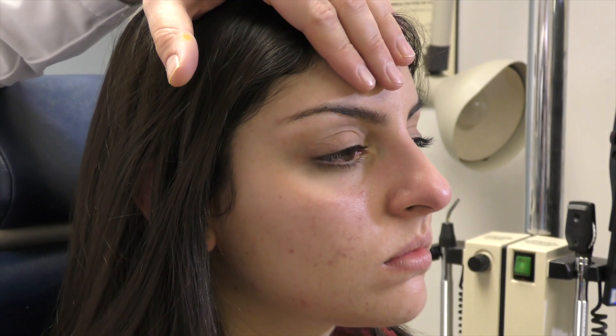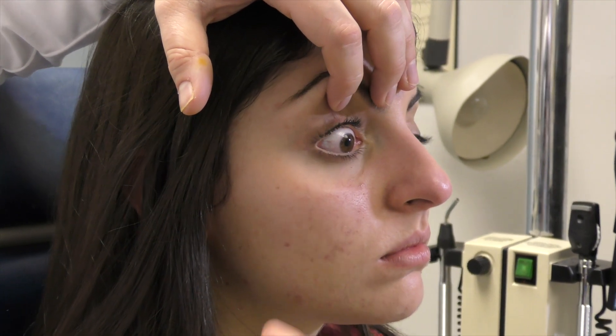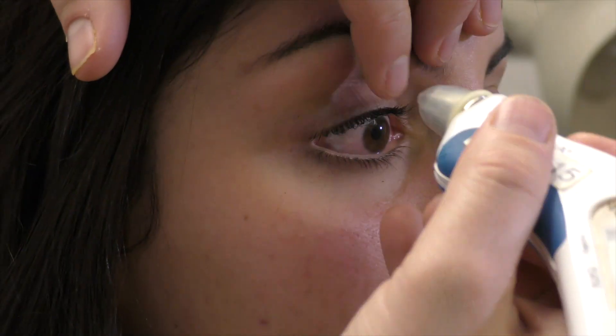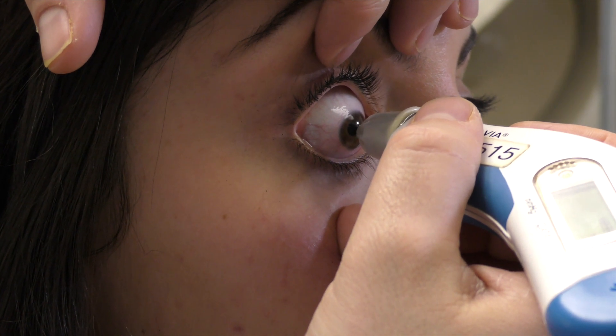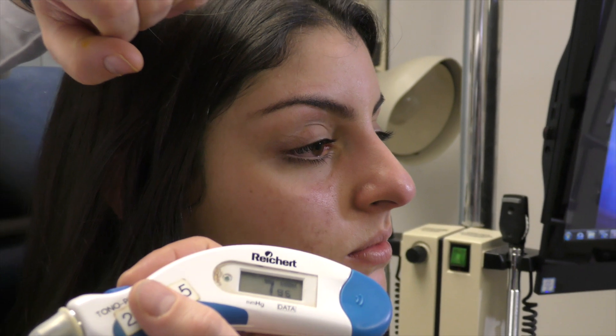With the patient in position, I place my right hand on their forehead to stabilize, and have them look straight ahead with both eyes wide open. I use my finger to lift the upper eyelid for better corneal exposure, and my pinky to pull down the lower eyelid. Now tap right in the center of the cornea — very gently, just a light tap, listening for the audible ticks. Once you have 10 ticks, it records the pressure. We got a pressure of 7 at 95% confidence, which means it's a very accurate reading. Intraocular pressure is normal.